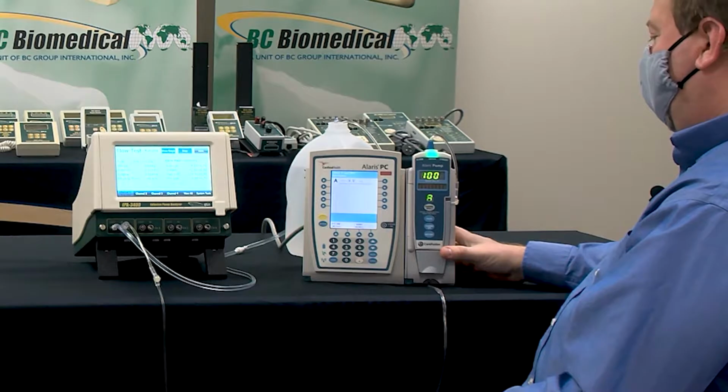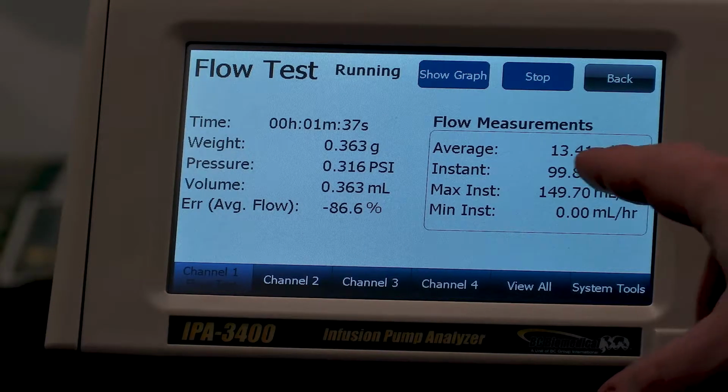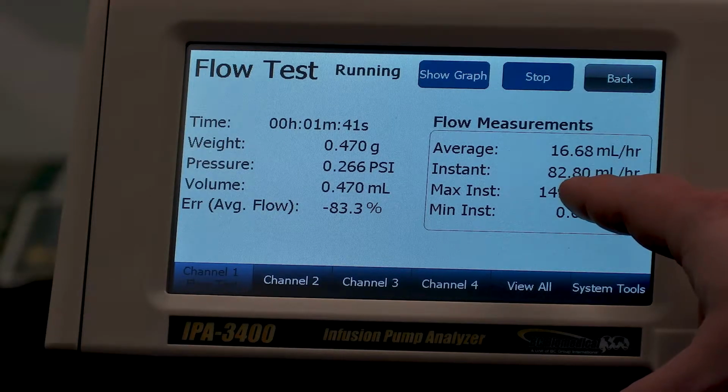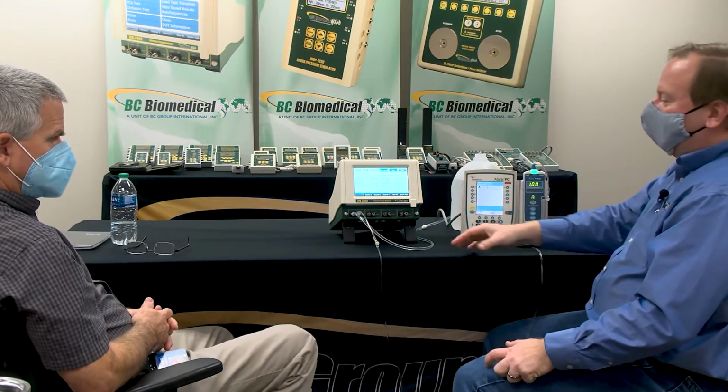Clog? Air in line. Oh, I did mention this is a very finicky pump, right? Okay, so now our average flow rate is 13 milliliters per hour, and our instantaneous flow rate is up at 100. What gives? Well, I hit start, and it was manual start, so when I hit start, I told it to go, it went. And so it's accumulating time. We get our average flow rate, volume over time. So you can introduce a huge error doing that, right?